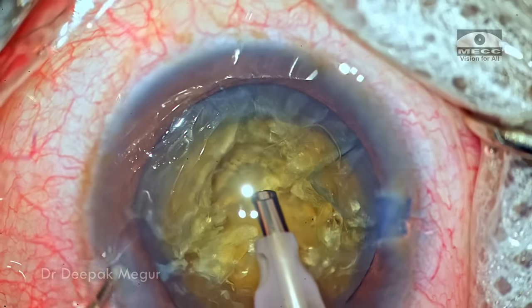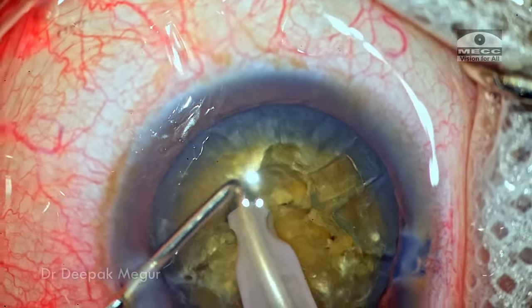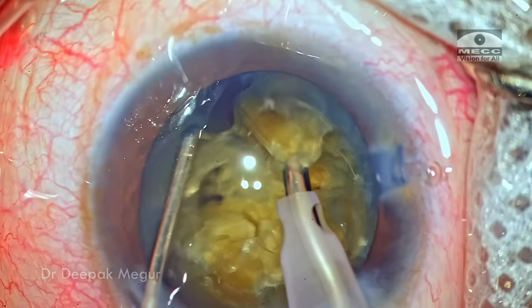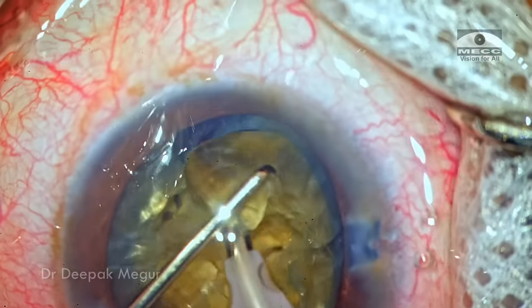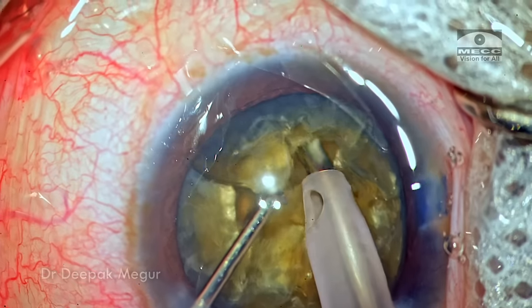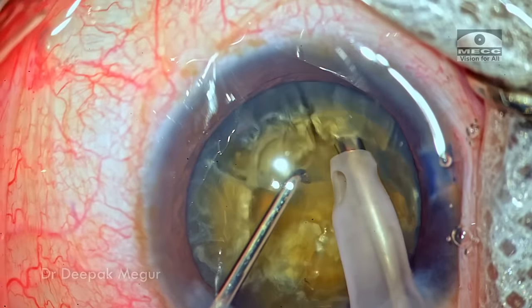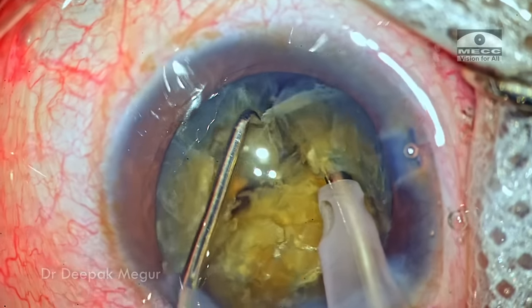Now is the time to perform the same maneuvers on the second hemi-nucleus. The challenge of torque will be present initially in the first two fragments, but in the second hemi-nucleus these challenges won't be there. It's easier to bury the tip and perform the vertical chop maneuvers. Such cataracts demand a lot of patience and care — being more focused and persistent means eventually most of these cataracts can be broken down quite comfortably.